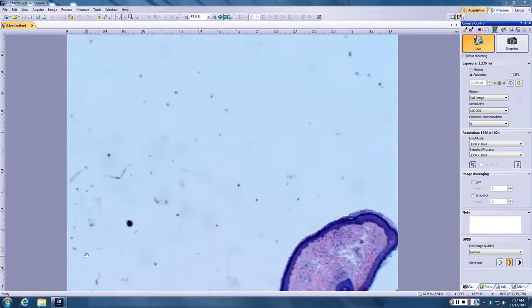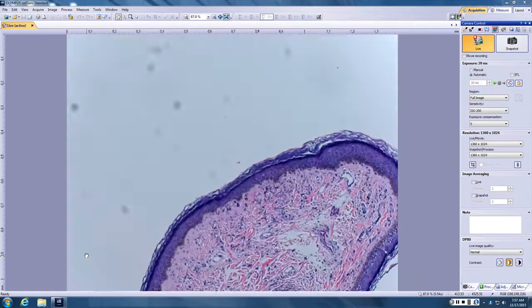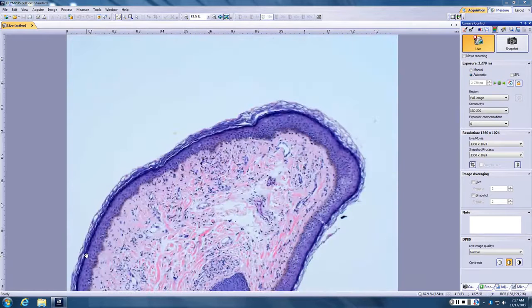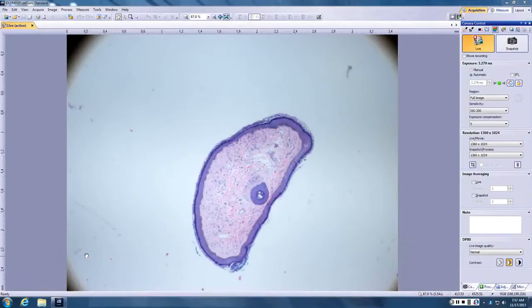Okay, so trying to decide if this is the shave of a little filiform papule. Either it's a shave of a papule that was small and stuck up, and this is a horizontal cut, or it's a full thickness clip of a very thin patient, right? That's one of the two. Like a CT scan? Yeah. I think that's the spinal cord at the bottom of the screen. More likely that this was a little bump and we just cut across. Okay, so I think you're good.